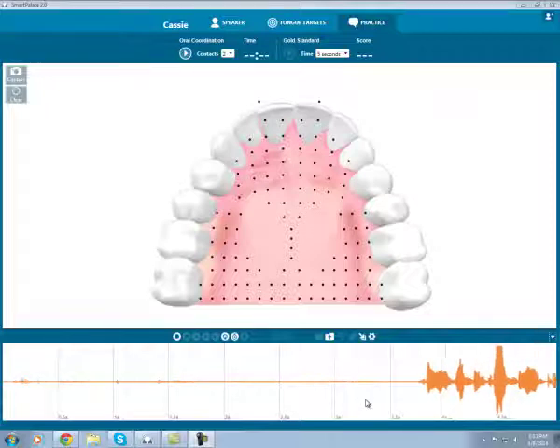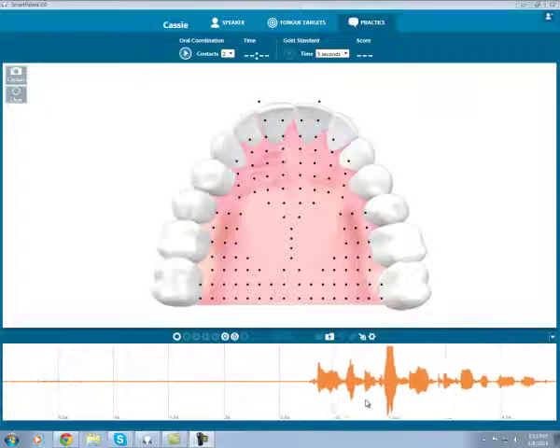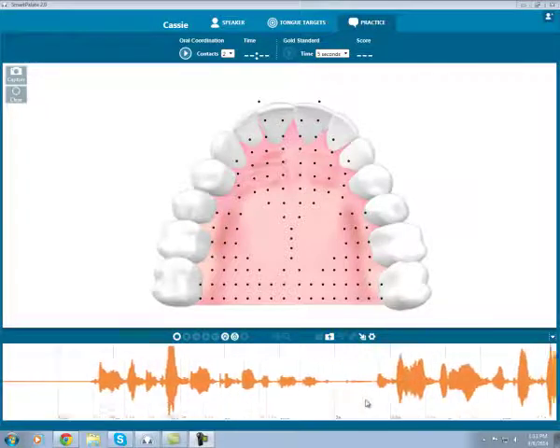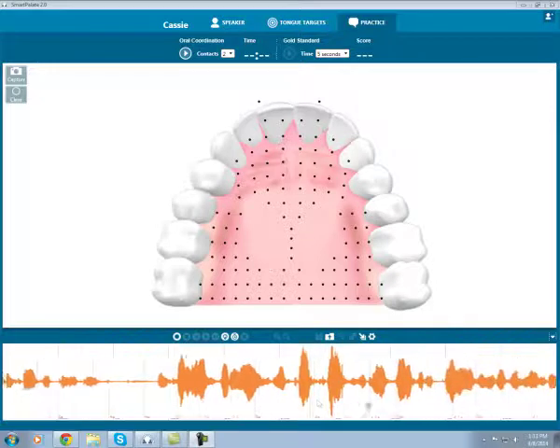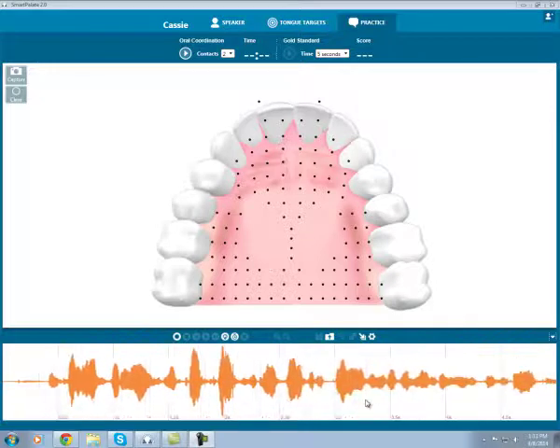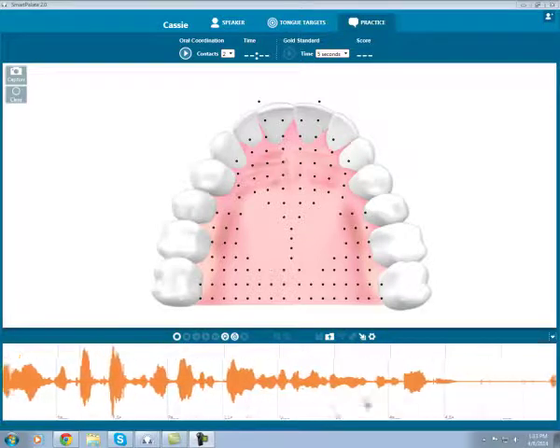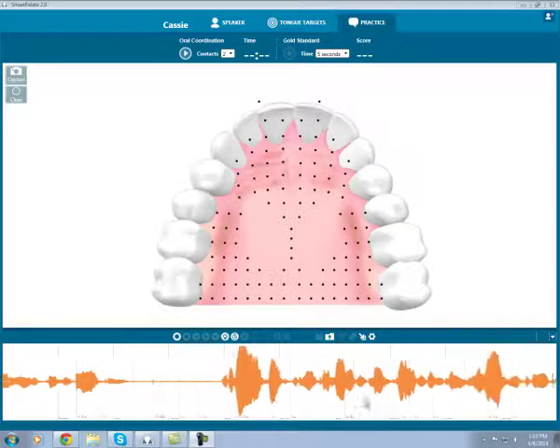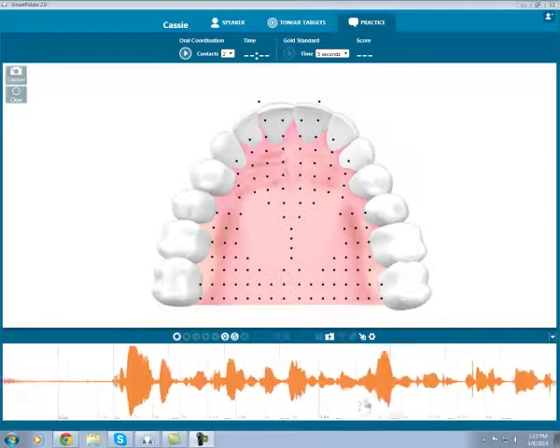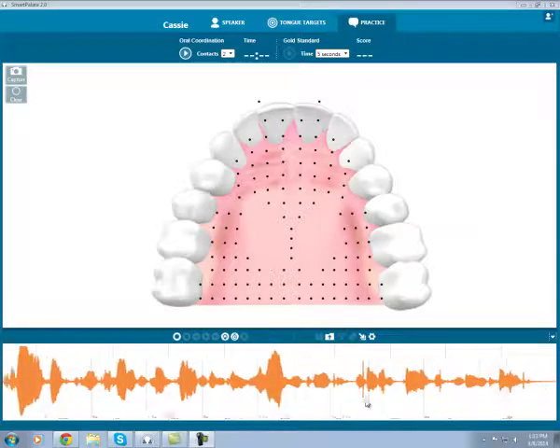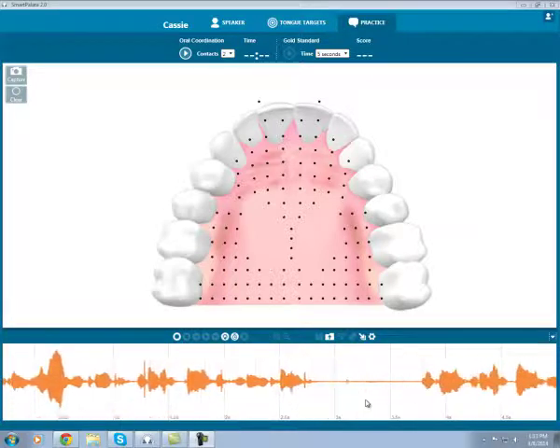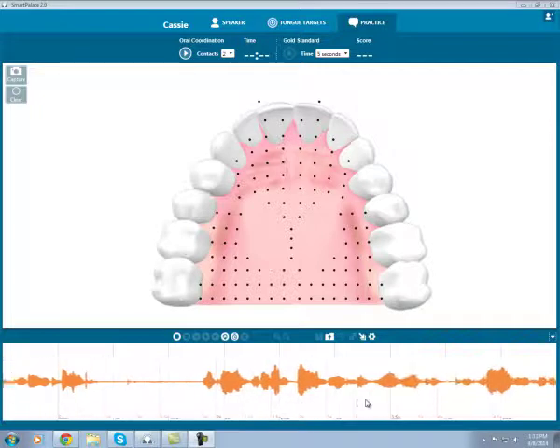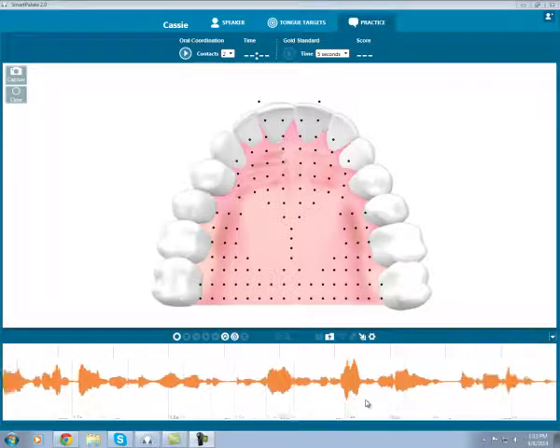Hi, this is Cassie with Complete Speech. In previous videos, we've talked about the SmartPalate display and different uses in speech therapy. Today I'd like to look at how the SmartPalate system allows you to look at two displays at the same time. Looking at two displays makes it easy to compare and contrast sounds and tongue targets.